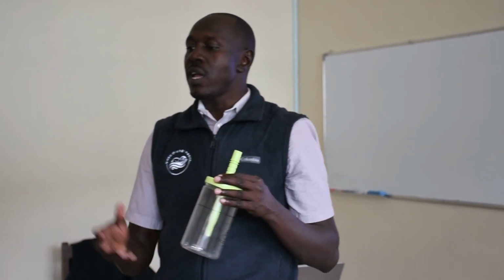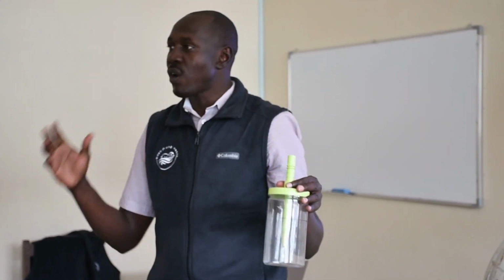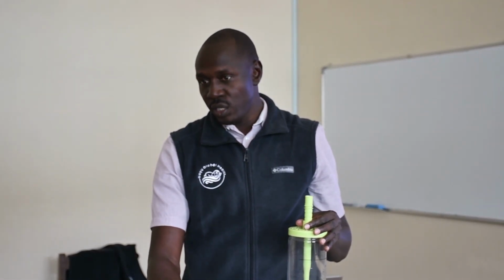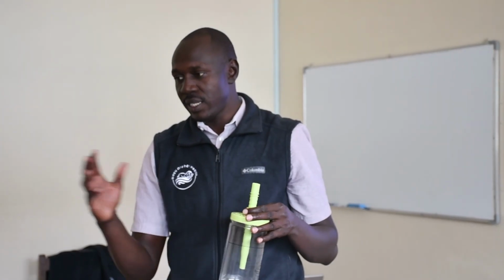Yes. If the work of breathing has reduced, maybe after 6 hours or maybe after 24 hours, then now you can think about reducing the pressures. But you start reducing the flow and the oxygen concentration before you reduce the pressures. That one we'll do later. We'll do it practically later. That's the next session.